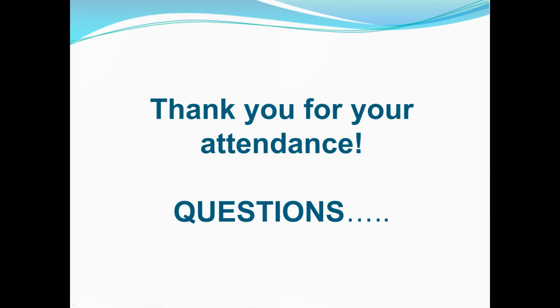All right, thank you. Our next question is, we tried the FDA-approved kit and had very poor results for gram positives, 30% ID. Did you experience the same? Do you have any tips for us? So unfortunately, we did not. We actually had very good results. And like I said, I think it was because we did the Sepsityper, and if we didn't get it from the rapid, we went into the extraction. I'm not sure if you did the extraction method with it. But once we did the extraction method, then we did have decent results, enough to get us over that 70% mark.